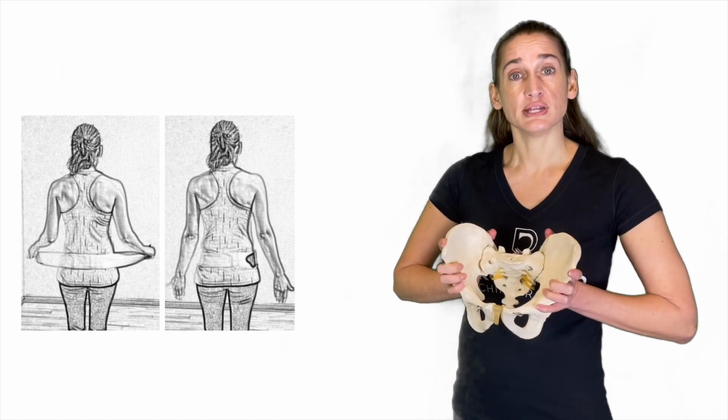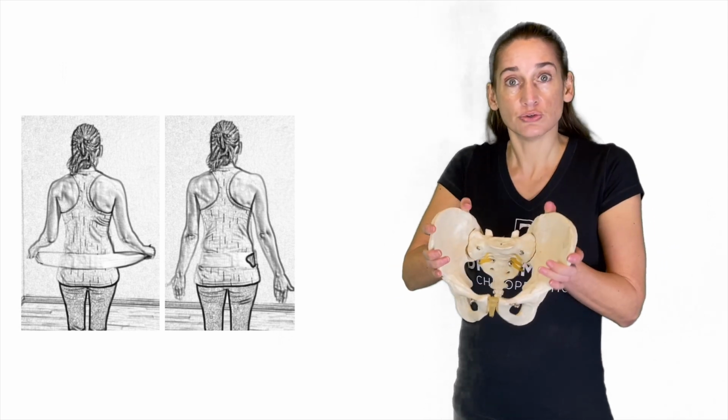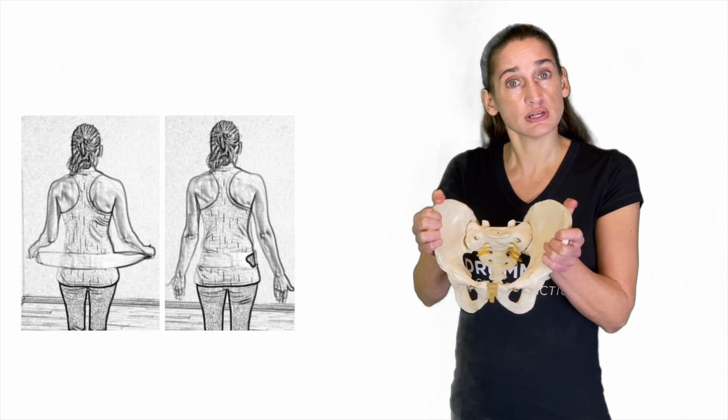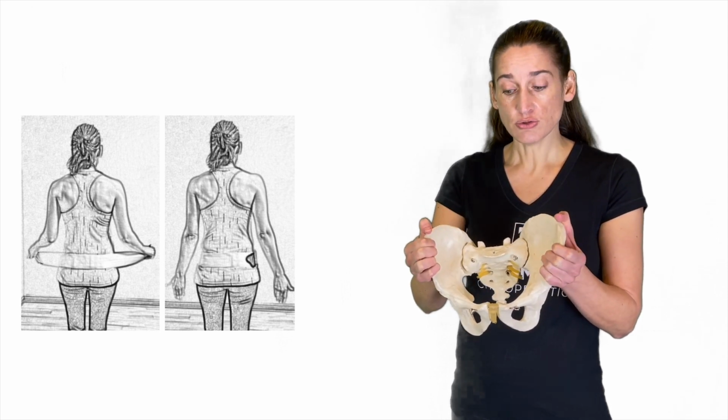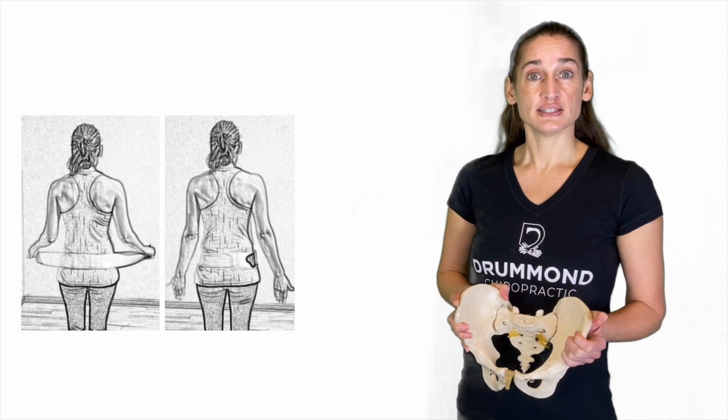But again, there's no muscle designed to do that. So if you use an SI belt, you're not at risk of weakening your muscles, because no muscles do this action. And notice when you squeeze the flat bones together, the tailbone doesn't wiggle as much. If I don't squeeze it, it's very loose. So let's go on to how to put on the SI belt.